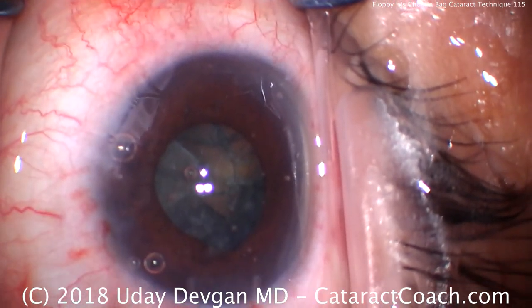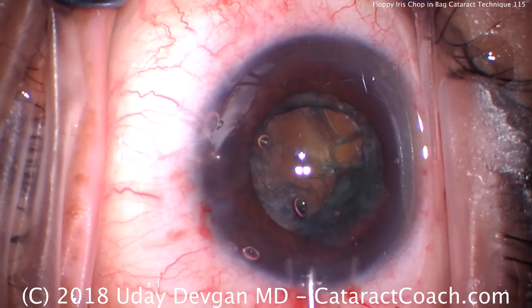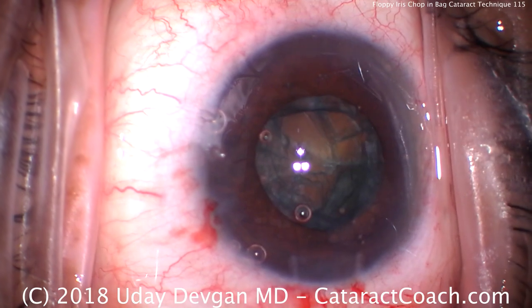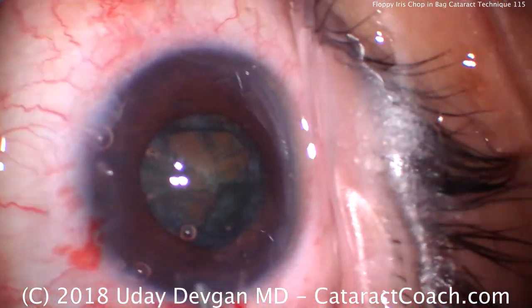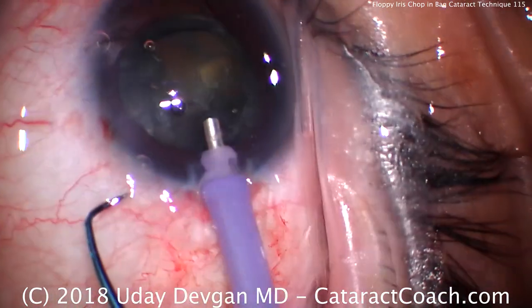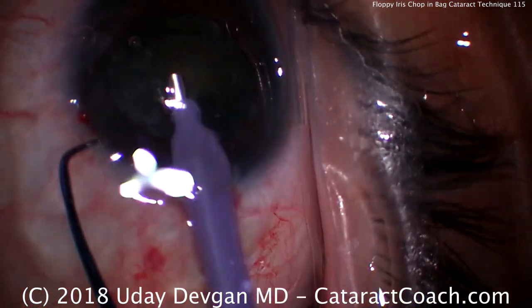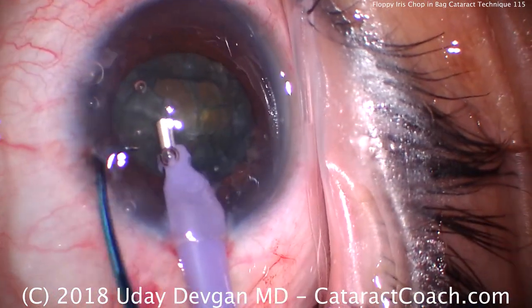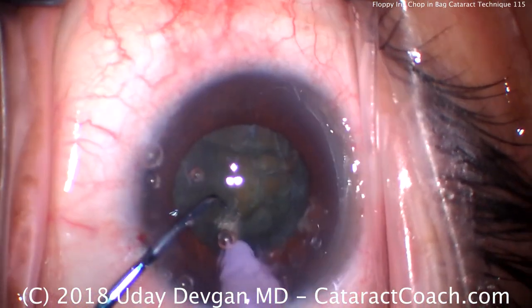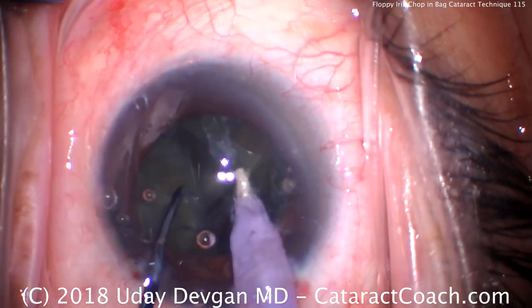Let's recoat the corneal endothelium with our dispersive viscoelastic — protect that cornea. Get the phaco probe in the eye. High vacuum, high flow settings. Moderate phaco power. High infusion pressure or bottle height. We're ready to chop. The phaco probe is going to go in the eye, and we'll get the chopper in the eye as well. Put the eye in primary position and we're going to chop it right in the capsular bag. Buzz in with the phaco probe right about now.